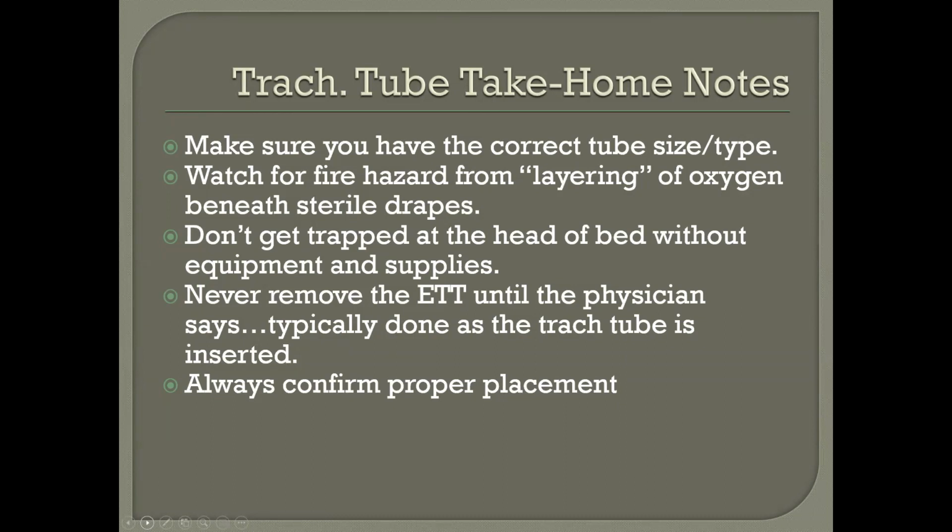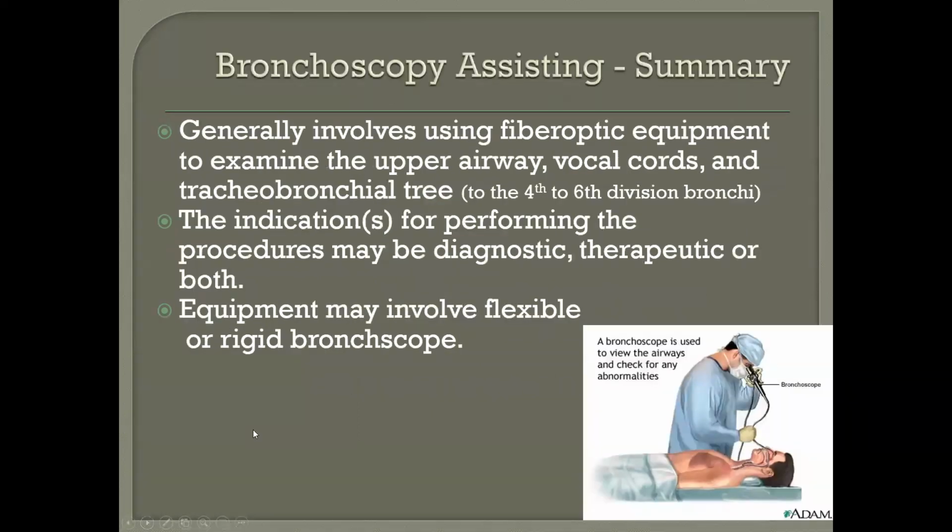Don't get trapped at the head of the bed without all the equipment and supplies that you need. Never remove the ET tube until the physician says so, typically done as the trach tube is inserted. Always confirm proper tube placement. No surprise there. Bronchoscopy assisting.